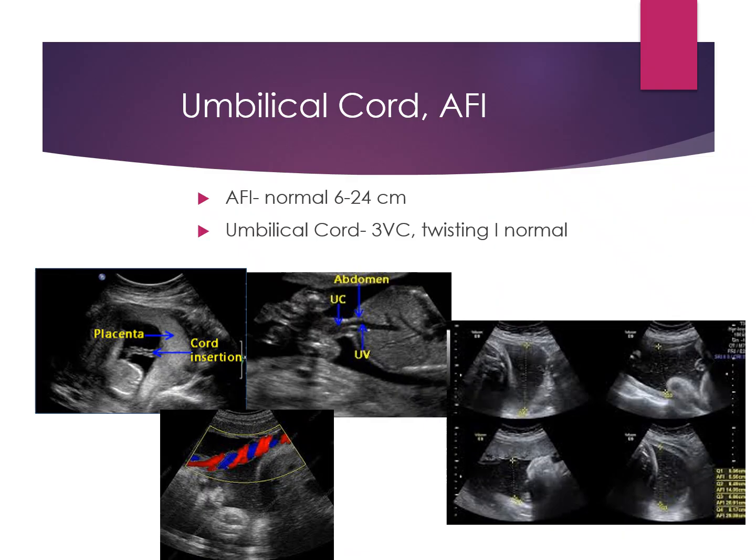The umbilical cord is what connects the baby's feeding system into the mother's blood supply. So this inserts at the baby's abdomen where we get our belly button from, and then connects into the placenta. And when we are doing a second trimester ultrasound, we need to show both of those insertions. One at the fetal abdomen here, and then one into the placenta. So we have our placenta here, and that cord is coming into it.